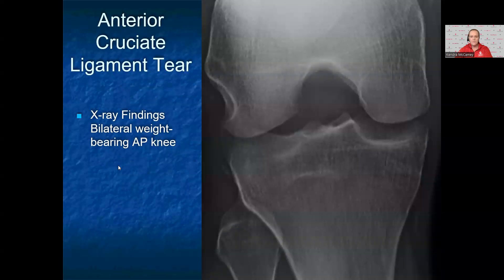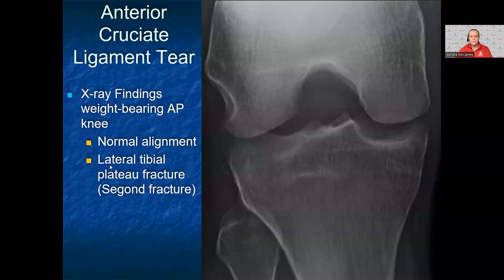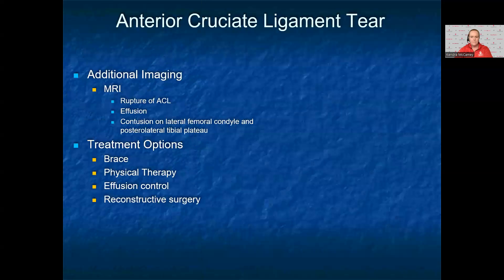This is her weight-bearing AP view that is magnified. This AP standing view shows normal knee alignment, but you can see a small avulsion of bone near the lateral tibial plateau — this is called a Segond fracture. When you see this, you need to assume that there is an ACL tear. For this history, you will need an MRI to further assess for internal derangement of the knee. The MRI can show an ACL tear, as well as any other ligament tear, meniscal tear, or bony edema from the injury. With an ACL tear, you will often see bony edema on the lateral femoral condyle and the posterior lateral tibia, consistent with bony contusions. Treatment includes bracing, physical therapy, effusion control by aspiration or medication, and surgery to reconstruct the ligament.